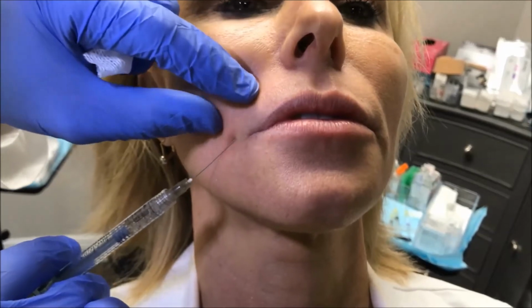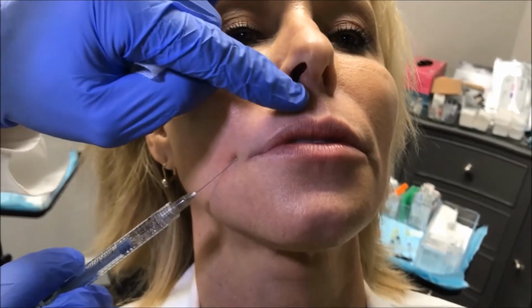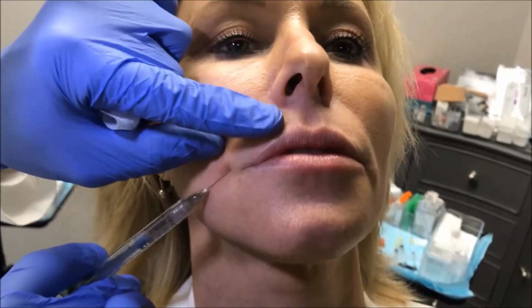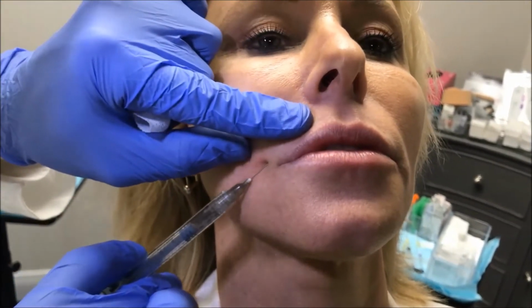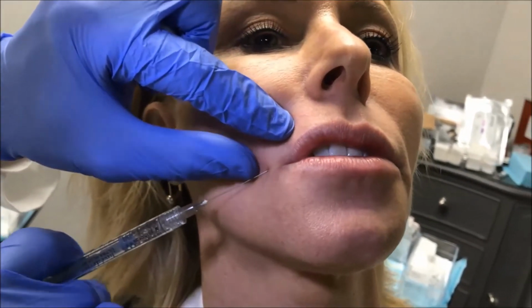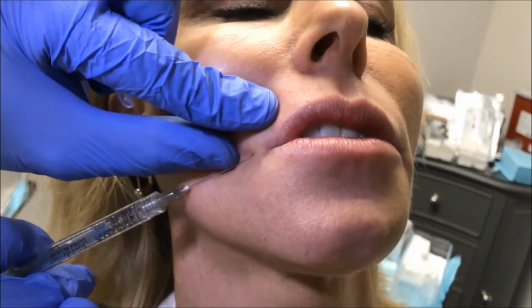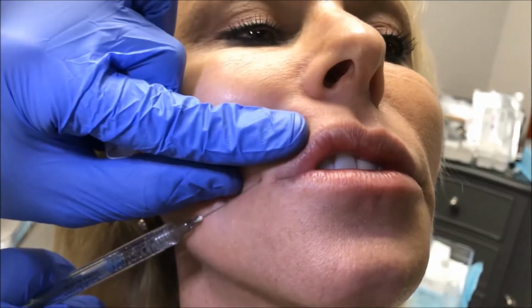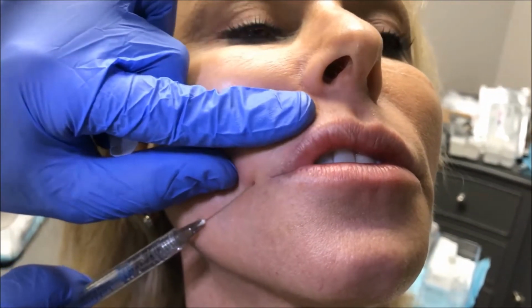Again, same thing I did on the other side. I want to treat a tiny bit of volume here, a little bit of volume here because of that dynamic upper cutaneous lip ledge that we noticed before we started treating. Okay, so I've done that. And now I'm going to come to the upper vermilion border. Again, using a micro cannula.